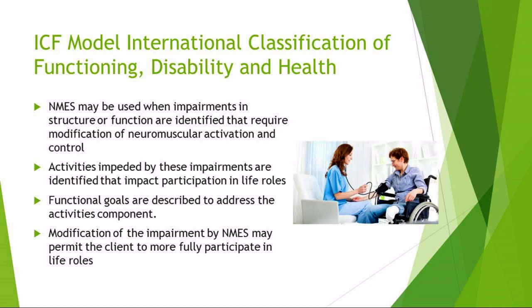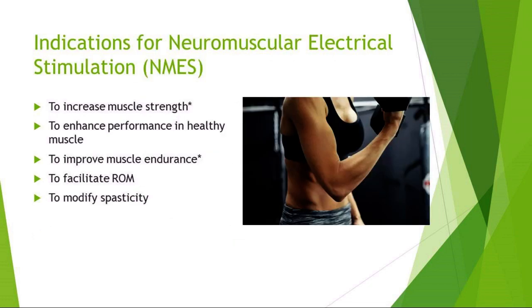Modification of the impairment by NMES may permit the client to more fully participate in their life roles. That's our goal. We want to get patients more functional, more able to do things that they need to do for their life, across all the interventions we do in PT.